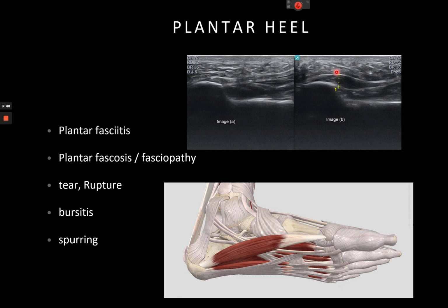The heel's very similar. You can have multiple tissues that are generating pain. It can be the heel bone itself. We can have some bone marrow edema. We can have edema in the superficial tissue and subcalc bursitis. And we can have fascial pathology. So it's about working out which structure we're dealing with.